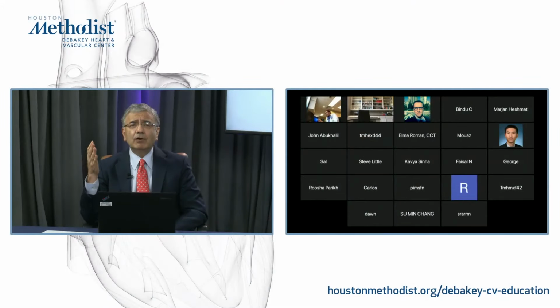Okay, thank you. So use it appropriately. Guys, if you're not seeing the left ventricle well enough to interpret regional and global function, this is the indication approved by the FDA, and this is very cost effective. We looked at cost effectiveness, because if you can't interpret, then you have to either guess clinically what you're going to do, or use another modality that may be even more expensive. So use it appropriately. Other questions?